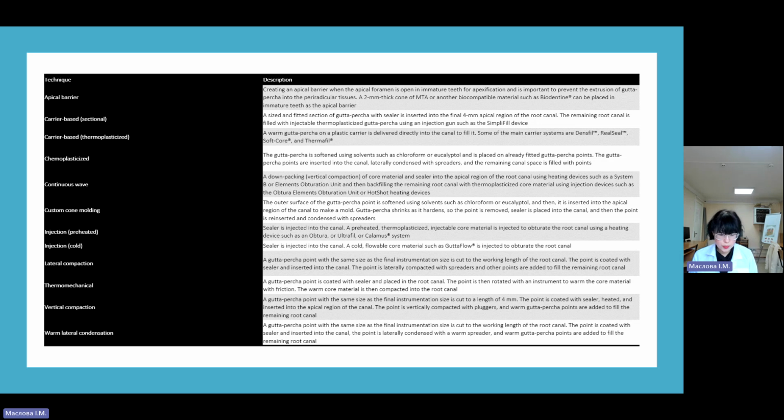Due to limitations of early root canal preparation instruments, curved root canals were difficult to enlarge adequately to accept semi-rigid materials such as gutta-percha cones. Rigid core materials such as silver points, first used in early 1941, could be forced down narrow canals and offered easy placement to the correct depths.